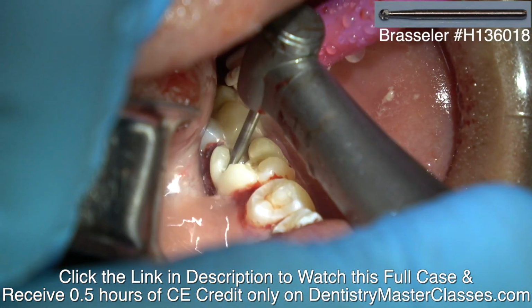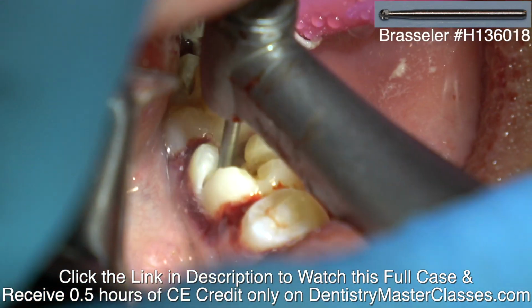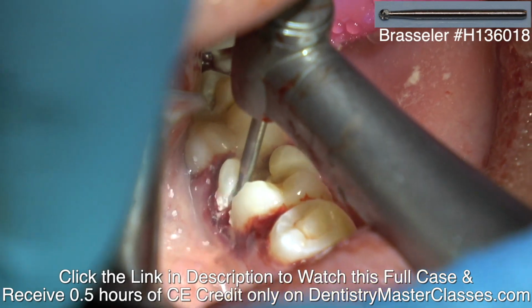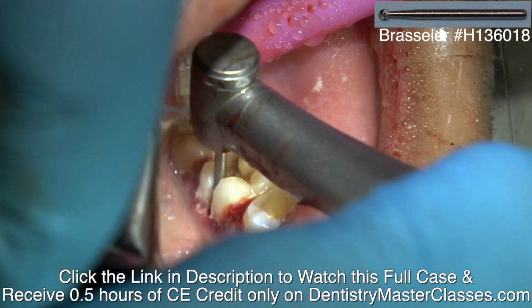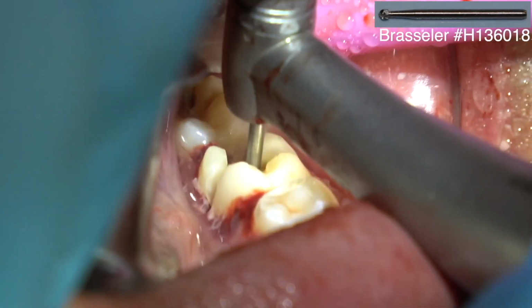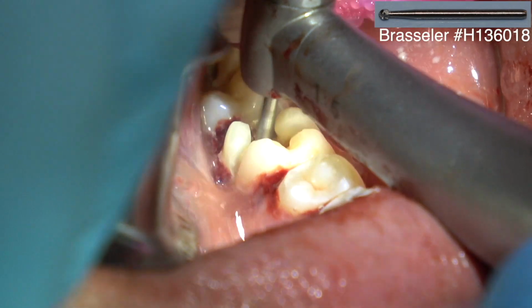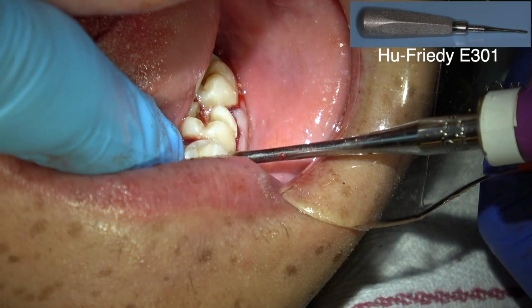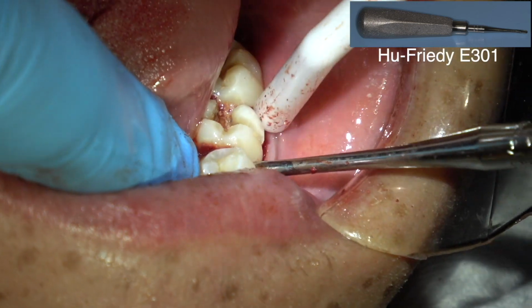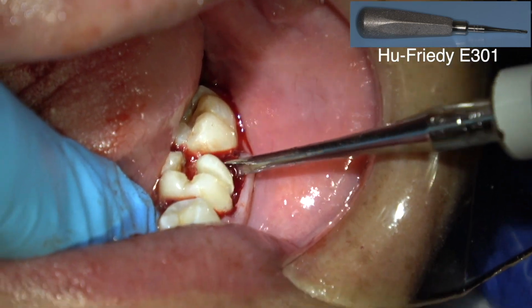So you'll remember there's distal roots and then two mesial roots. Sometimes there's two distal roots, so I want to section the tooth between the mesial and the distal roots. I want to be sure to go past the furcation. You're not really worrying about damaging the inferior alveolar nerve because you're not sectioning near that apically into the tooth. So I'm not removing any buccal bone.